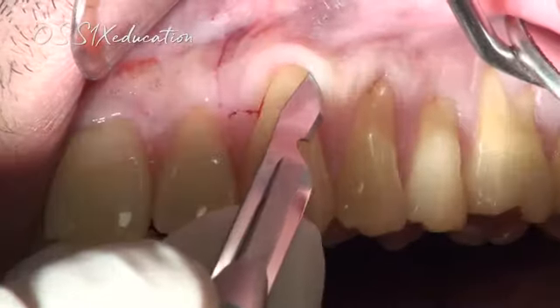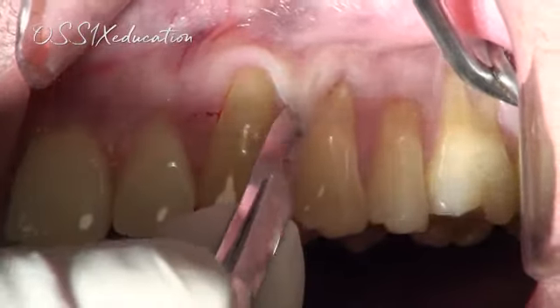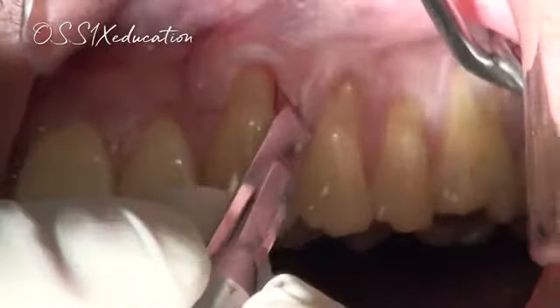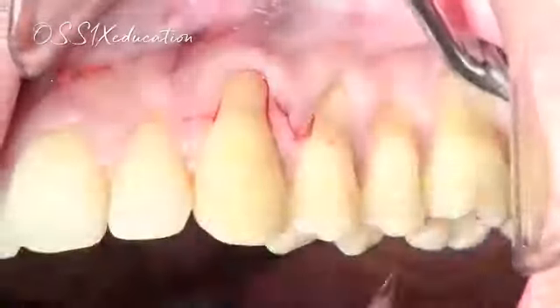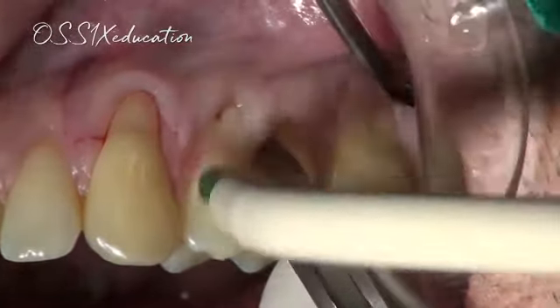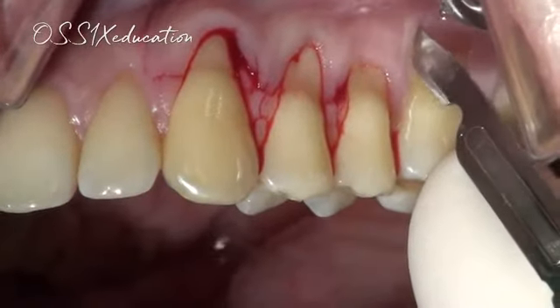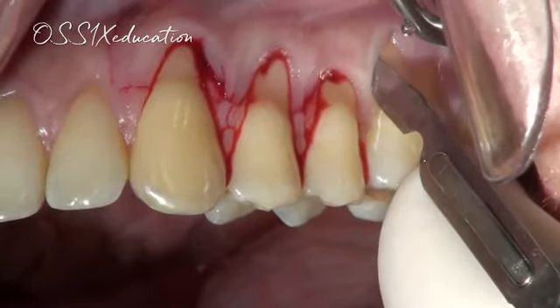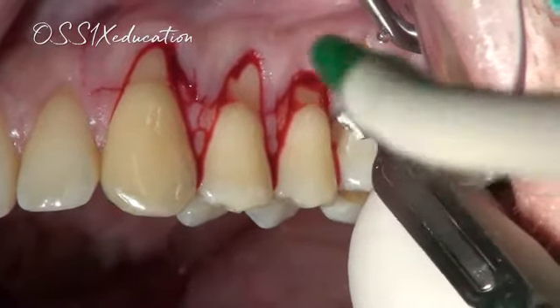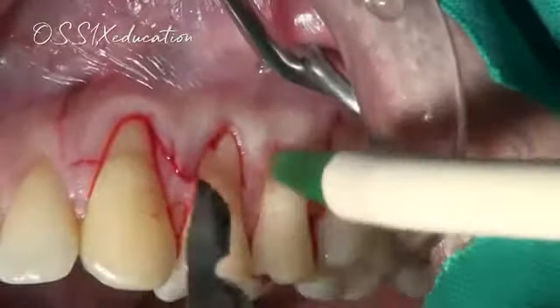Okay, so in this case, we're doing a modified envelope flap with a vertical releasing incision on the mesial side, as you can see. The other incisions are going in the usual manner, from the line angle of the cemento-enamel junction of the neighboring tooth to the most apical part of the recession on the other tooth. In this case, we decided to choose the first premolar as the central tooth.